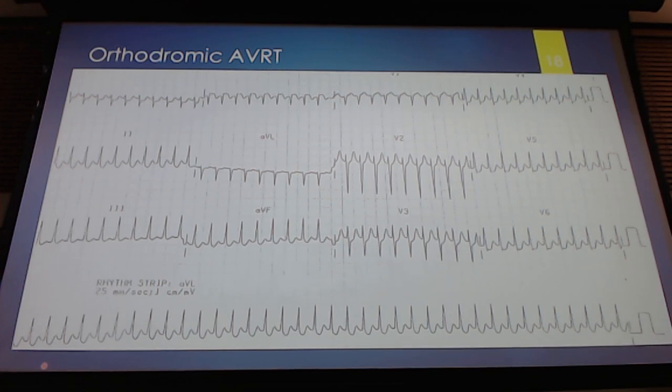So what you guys remember, I think maybe the second lecture, I said that if you have a really, really fast heart rate, is there a way that we can slow this down? Is there a way that we can do something to slow this down so we can identify, do I actually have P waves or no? Box breathing, you said. What did you say? The box breathing, whatever. So yeah, we can do something to the EKG machine, right?